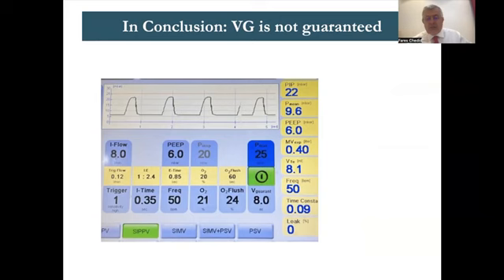Let me show you what are the things that could affect the volume guarantee. One of them is a leak. If you have a leak of more than 50%, the PIP will shoot up. Second is when the volume guarantee is too low. If it's too low, the baby will take much more volume and either the pressure will go down to PEEP, or you will find yourself with interrupted breaths and the baby will get excited and breathe fast. So the volume guarantee is not always 4 ml/kg or 5 ml/kg. It might be increased when the baby gets a healthier lung.